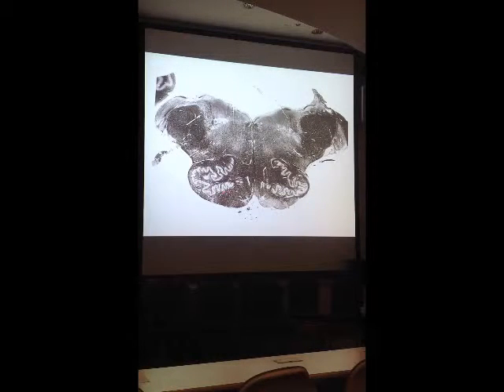And again, why is it medulla? Because what's this structure right here? It's the medullary pyramid. What's wrong with this one over here? Well, that's a scar. We talked about that. This person suffered a stroke in life, and so this is a scar. The fibers that made up this pyramid are gone. Okay, so there's a pyramid.